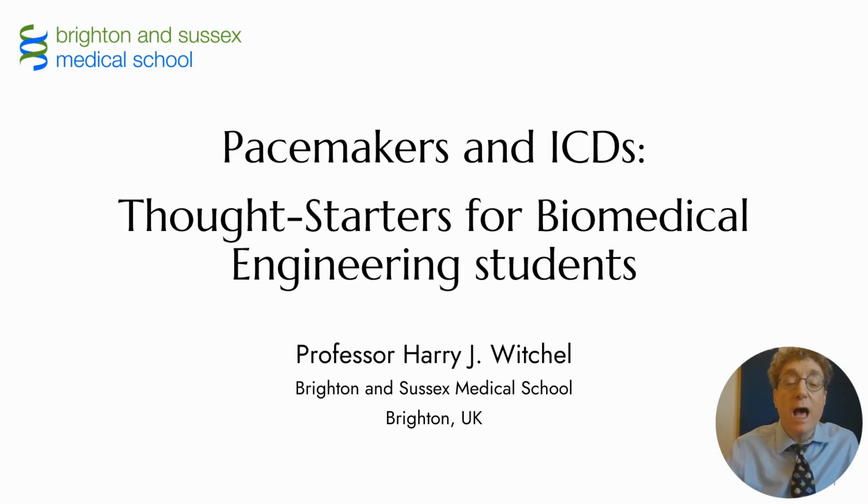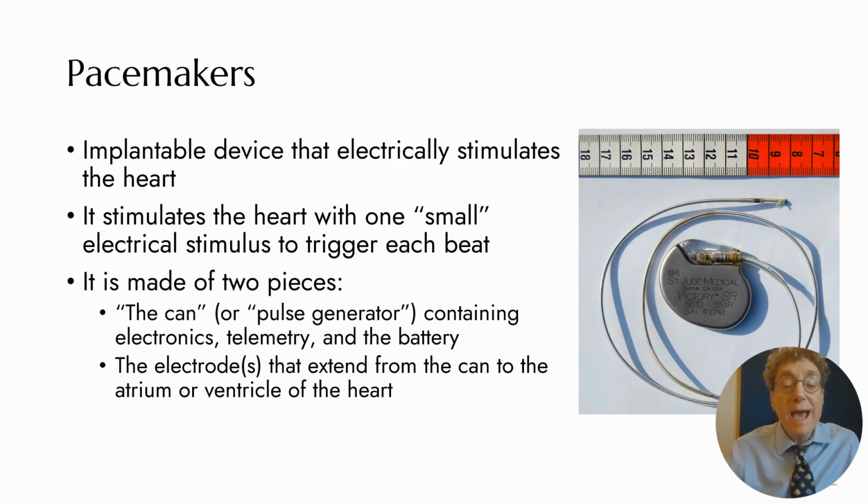And this video is a thought starter for biomedical engineering students. We're going to be talking specifically about pacemakers and ICDs, that is implantable cardioverter defibrillators. So a pacemaker is an implantable device that electrically stimulates the heart. It stimulates the heart with a single electrical stimulus to trigger each heartbeat. That is, it's stimulating it beat, beat, beat, one beat every time.